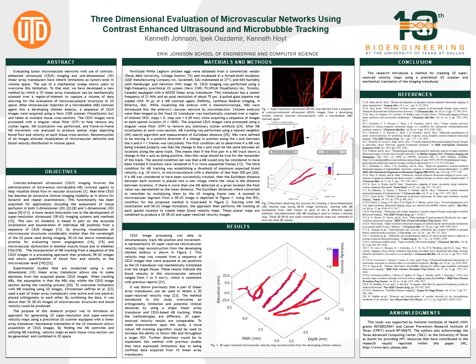It has been shown previously that a pair of linear array transducers placed orthogonally can be used to obtain a 3D super-resolved velocity map. The method introduced in this study overcomes the orthogonal limits and potential clinical obstacles by using a single linear array transducer and contrast-enhanced ultrasound imaging-based microbubble tracking.